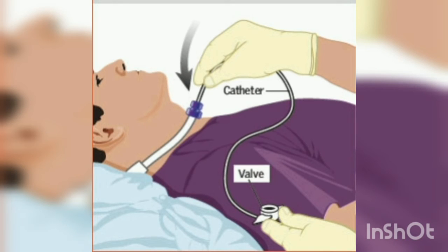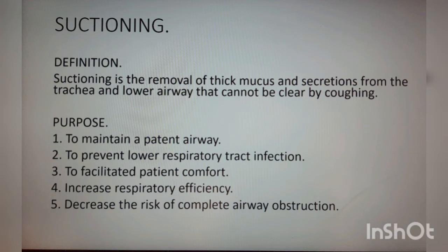Now we'll go with the suctioning procedure. As you can see in the photo, the patient is undergoing suctioning. Now we'll come to the next procedure, that is suctioning. So we'll see first the definition.